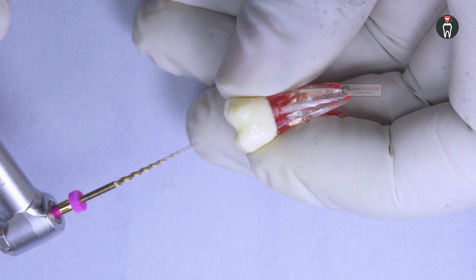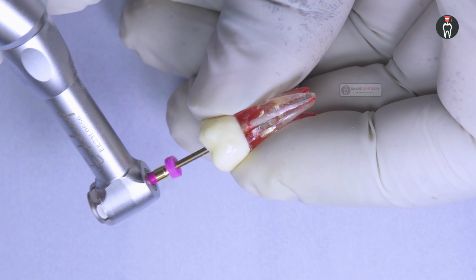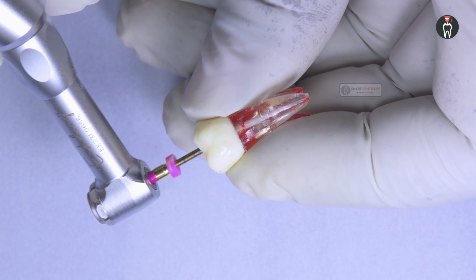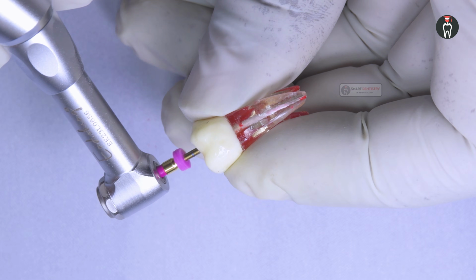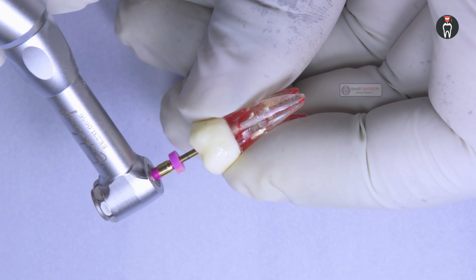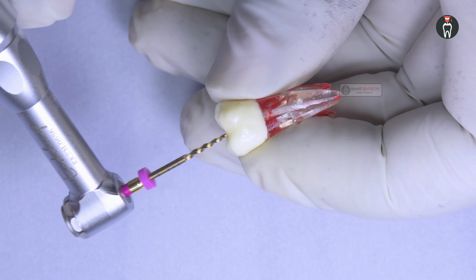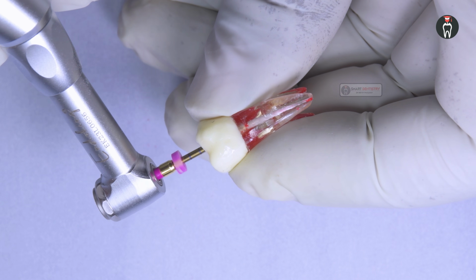I hope this technique is really helpful, because with a reciprocative motion there is no need to go the full length of the root canal. Just prepare the coronal and the middle third with a reciprocative motion. After the coronal and middle third preparation with reciprocation, you can go for the apical third preparation in a rotary motion. So the easiest technique to follow is coronal and middle third preparation with reciprocation, and you can also consider using a brushing motion.